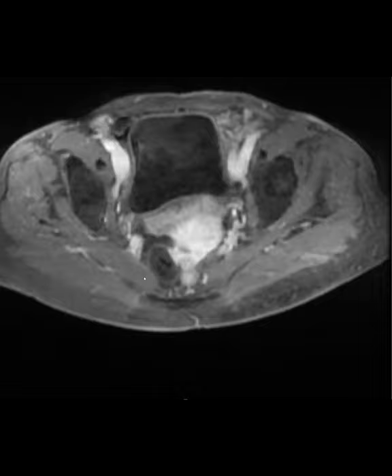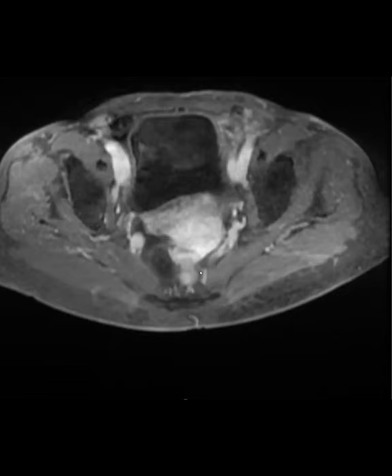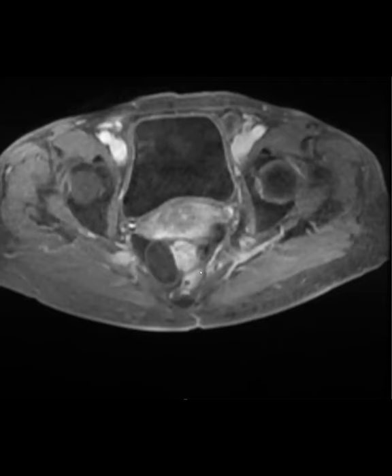On that, it looks like there's a bridge. I would just confirm on every single view, your sagittal, your coronal. A weird degenerating fibroid right there. Right, like right there. No, keep going back. Right there. Okay, that's your bridge. It's almost like she's got a pedunculated degenerating one off of an enhancing component of it. But yeah, maybe it's some kind of dumbbell fibroid that looks weird.